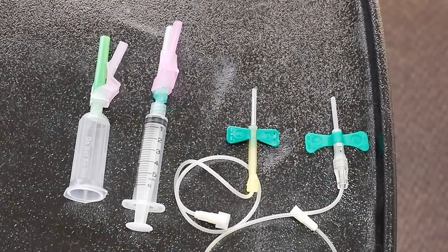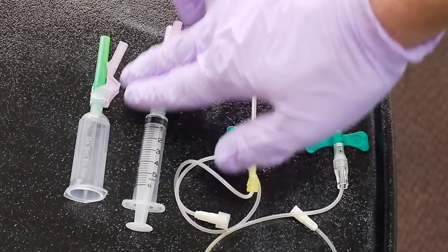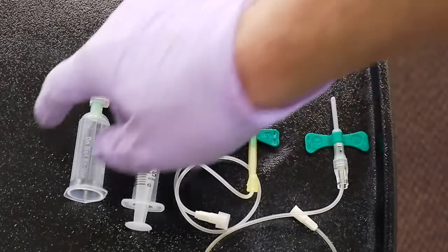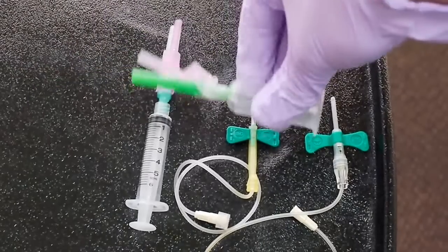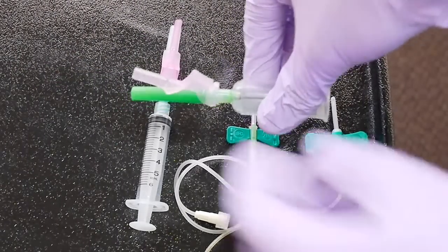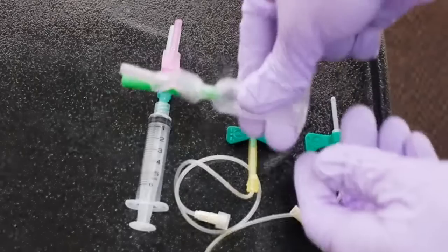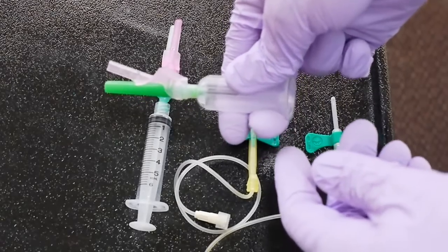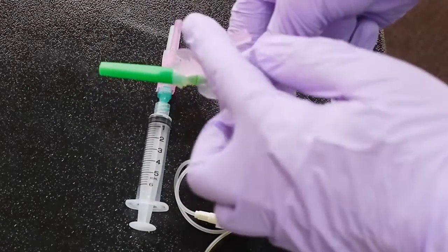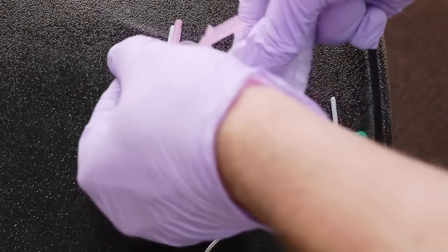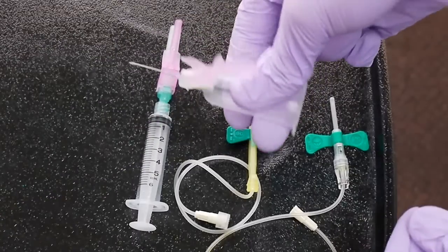So the first one we're going to talk about is the one for the ETS system, evacuated tube system. You can see that the needle is capped and the safety lock is in the up position. Normally what we would do is pull back on the safety lock, take the cap off, and then we would be ready to do the blood draw.